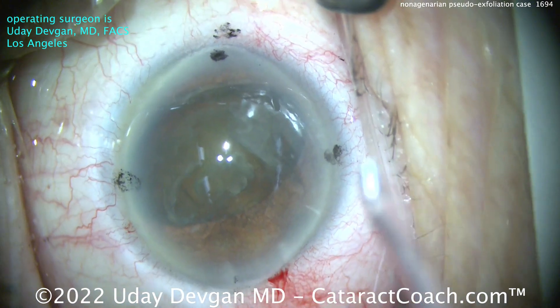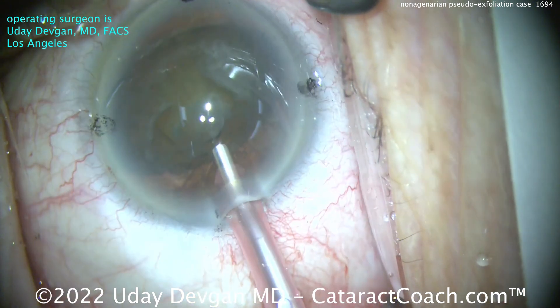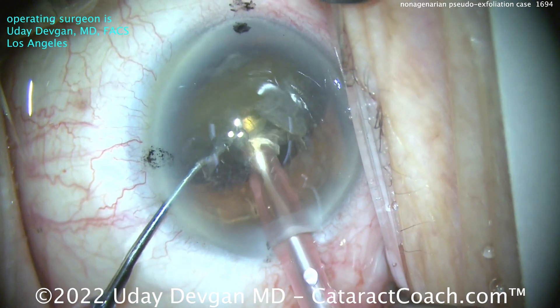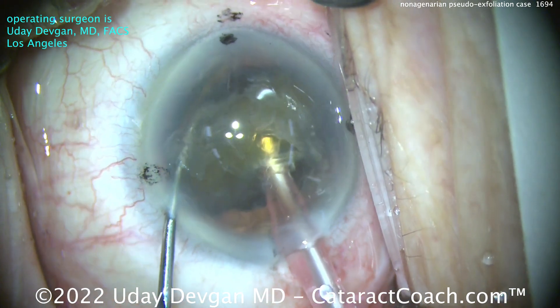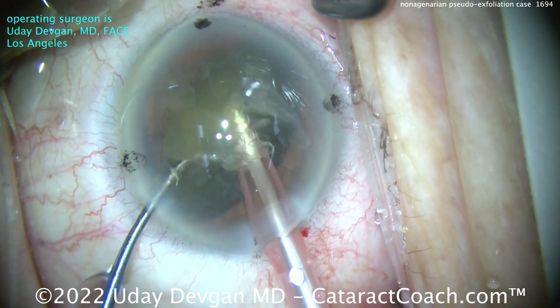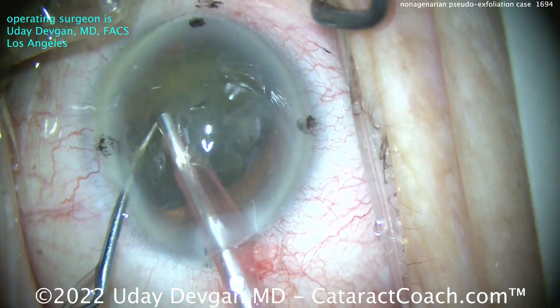Coming over with the phacoprobe now. The nucleus is being held by the pupil, which keeps the pupil open and keeps the nucleus in position. Buzz with the phacoprobe, get that chopper around the backside, and there's the chop. Now the nucleus is split into two halves, and you can emulsify each half and aspirate them down.